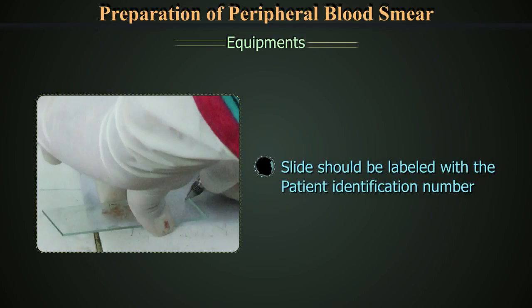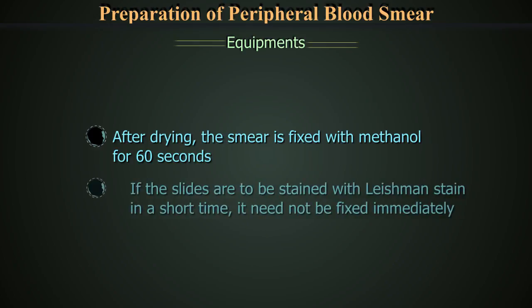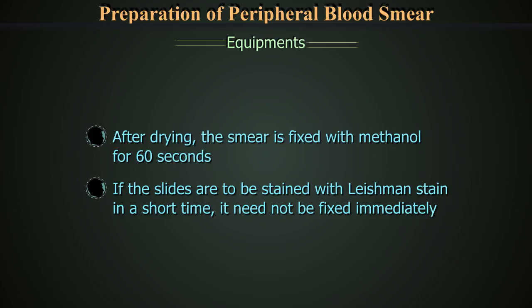The slide should be labeled with the patient identification number using a lead pencil on the head — that is the thick end — of the smear. After drying, the smear is fixed with methanol for 60 seconds prior to storage. If the slides are to be stained with Leishmann stain in a short time, it need not be fixed immediately.